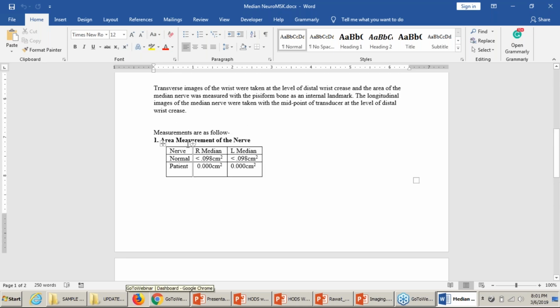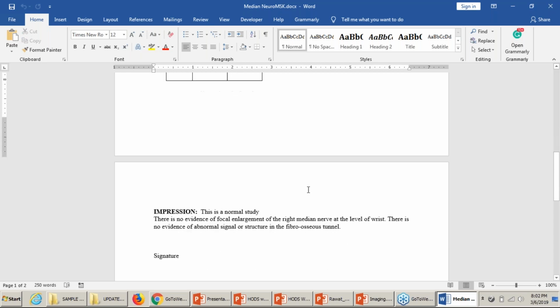So far, these are the most... clinical utility of cross-sectional area is much higher than other measurements. So you get more out of this finding than others, but you can definitely include as much data as you have for that nerve. So if you're doing ratios, you can include that here.